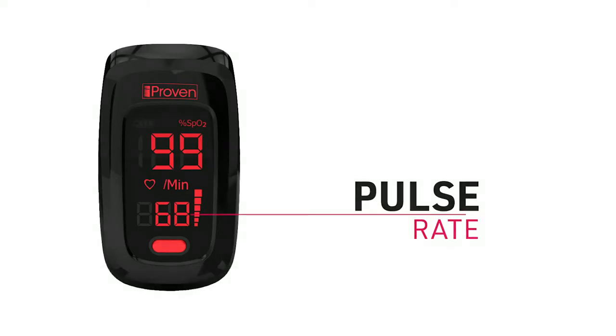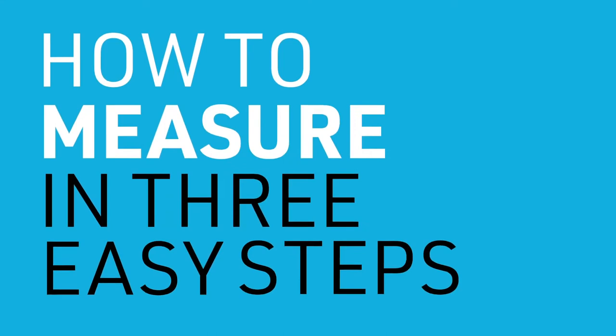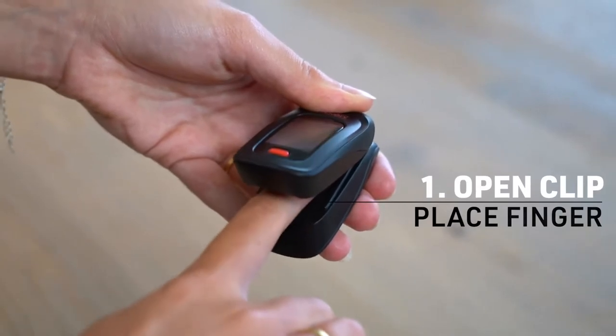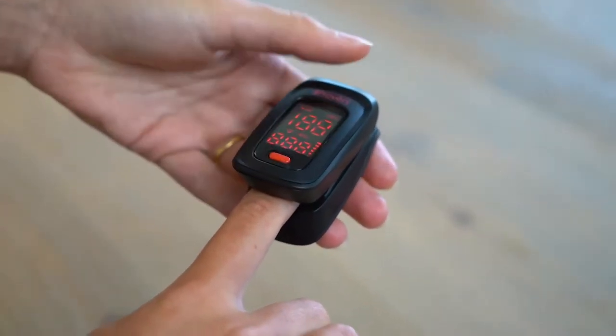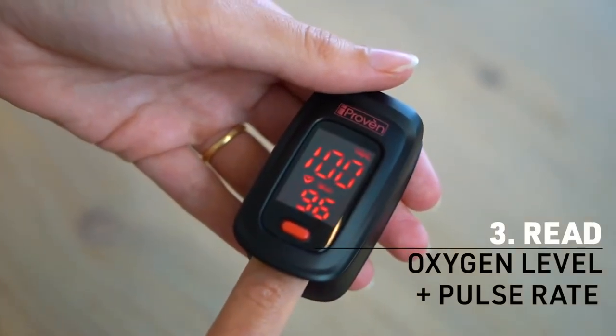In addition to measuring the level of oxygen in your blood, pulse oximeters also track your pulse rate. Your pulse rate is shown on the display as beats per minute. How to measure in three easy steps: One, open the clip and place your finger inside. Two, press the start button. Three, read your oxygen saturation level and pulse rate.